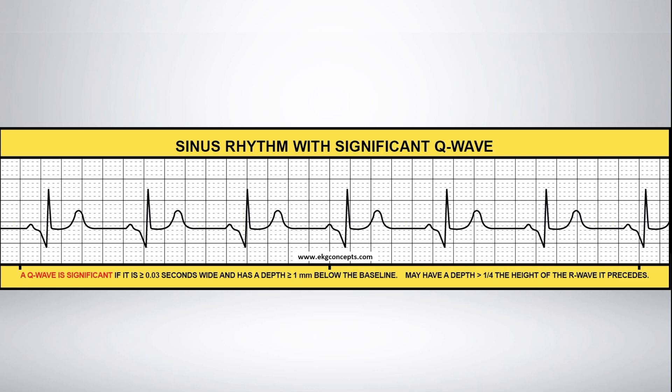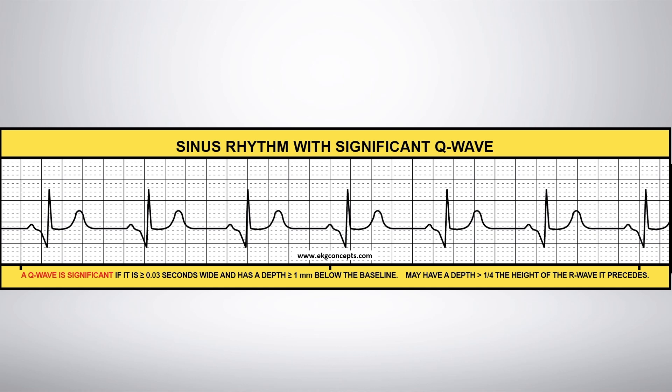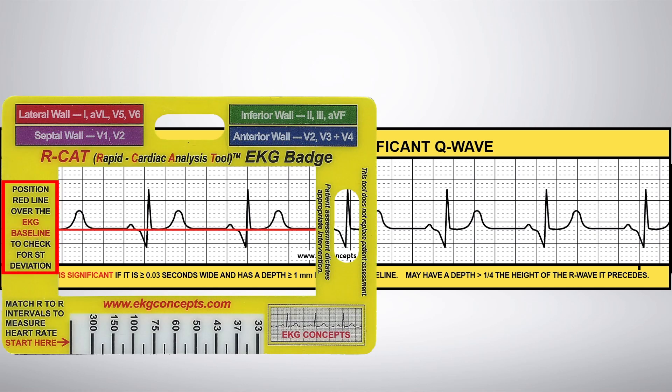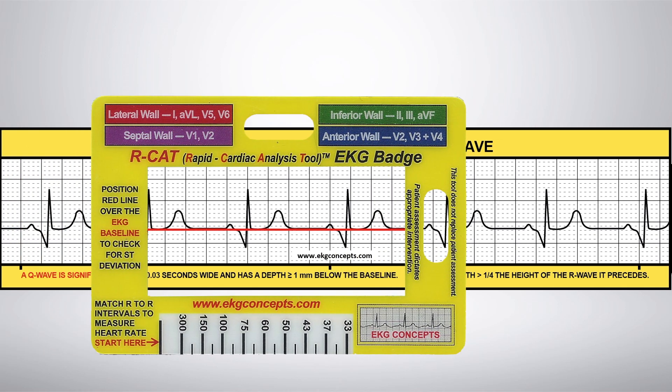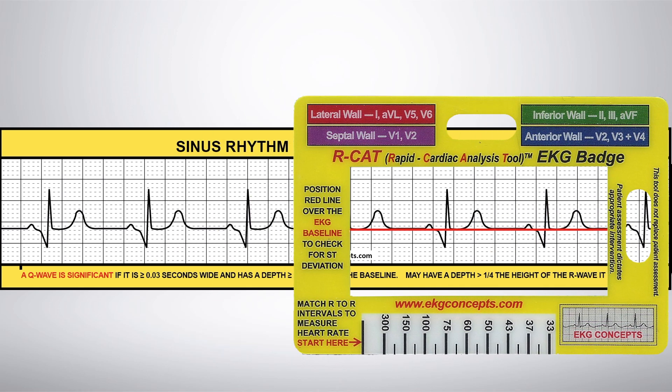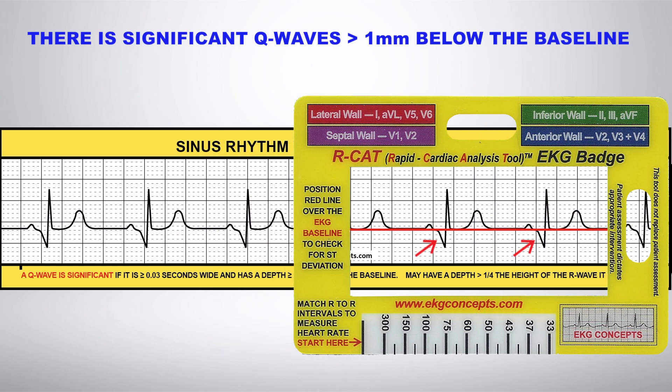Using the EKG badge, align the red line on the baseline and slide the badge along the rhythm strip looking for ST deviation. This rhythm shows that the Q waves are greater than 1 mm below the baseline.